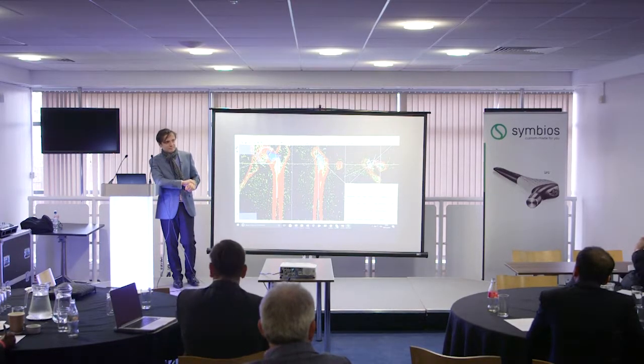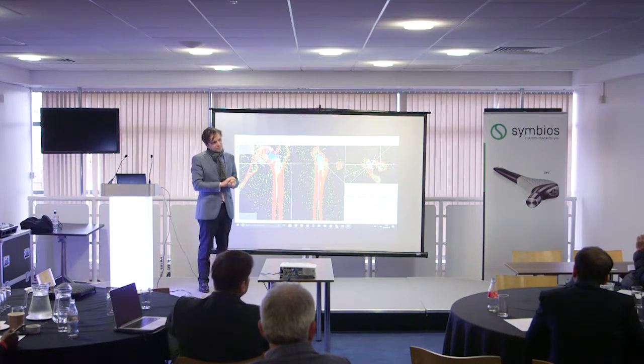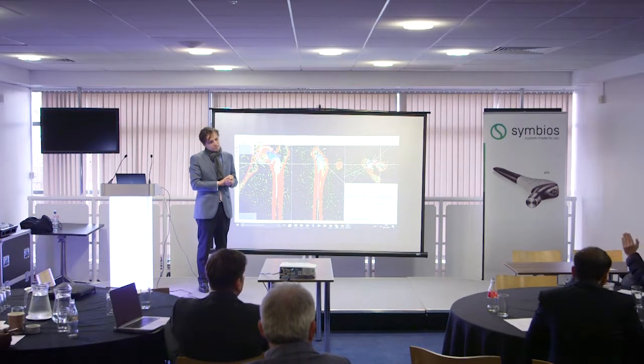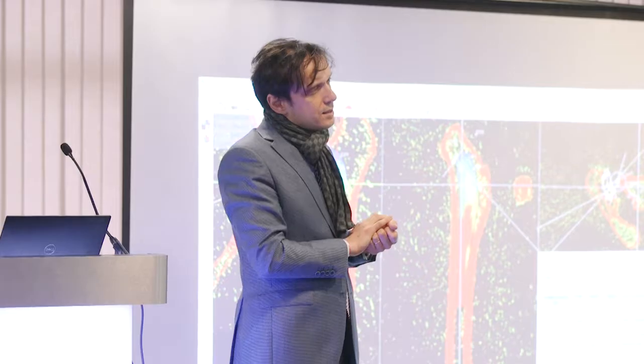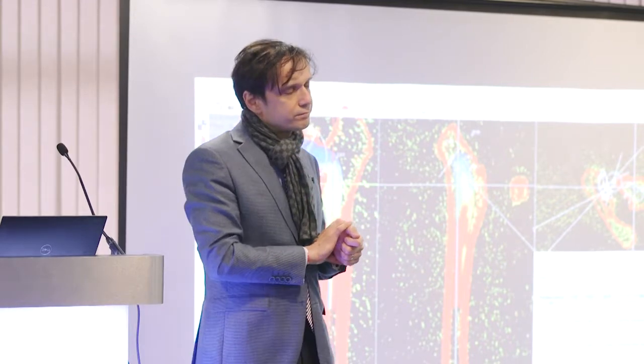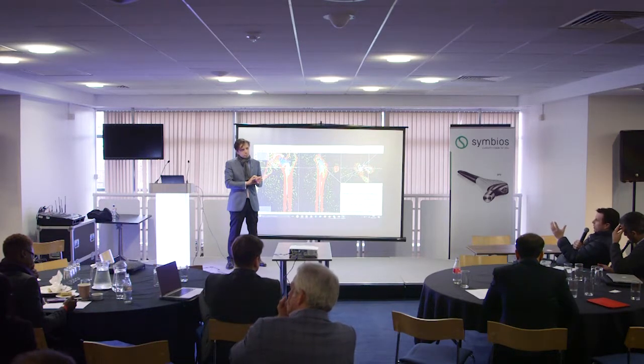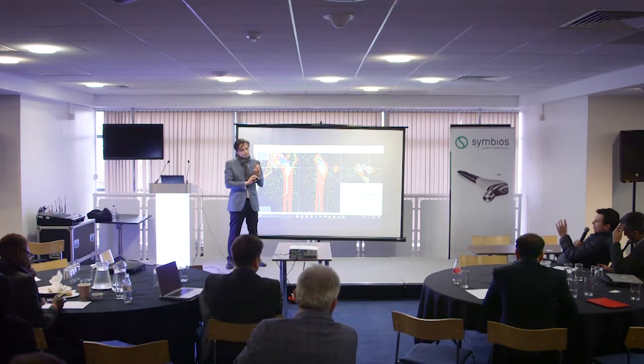Often the plans that come back from Symbios, if someone has a particularly reduced, abnormally short lateral offset, the plan will come back with an increased offset towards normalization. But the penalty of that is increased soft tissue tension laterally. And there's clearly a sweet spot where one gets a better offset in terms of mechanics and wear, but without the penalty of the soft tissue tension being increased. And it's just what your thoughts on where that sweet spot was.